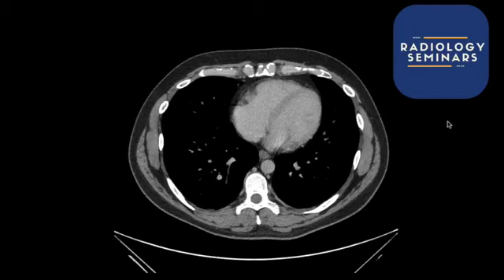So what we're going to be going through, hopefully, is a bit of basic anatomy in this particular lecture, just so that we get acquainted with the anatomy of the abdomen and pelvis. And also, this will hopefully set us up for the next few lectures that we've got planned.